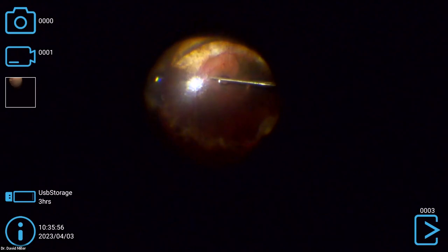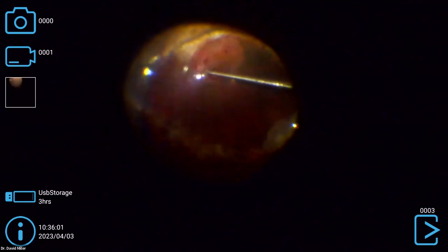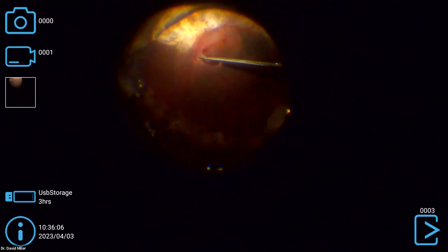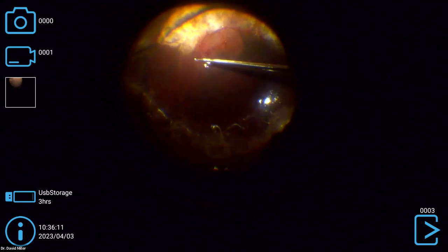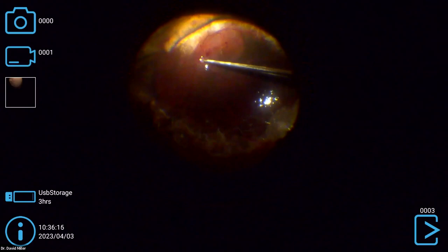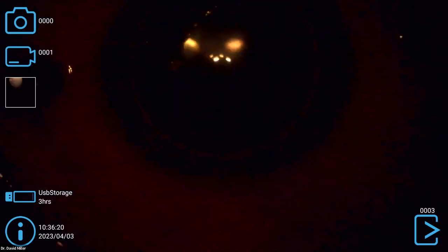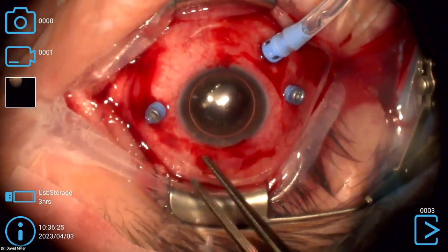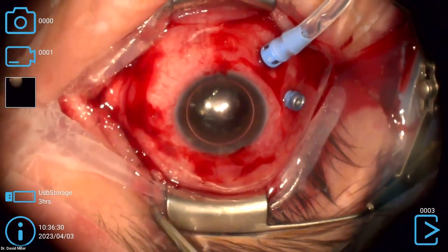Now it's a matter of seeing what we can recover for vision. I know that hand motion is where we started. She's going to focus this for us a little better. As we go to the air, there's often a change in focus and some glare. Sorry for that, everyone. We'll try and get you the best views we can. That's about it. So now we're going to go through the wounds again. You can see the air bubble in the anterior chamber. It doesn't bother me at all. Aphakic eye, he'll be fine with a little face down positioning if there's any pressure issue.